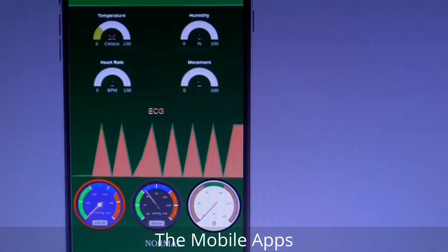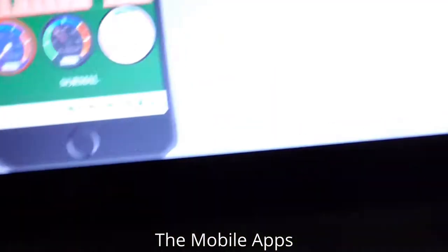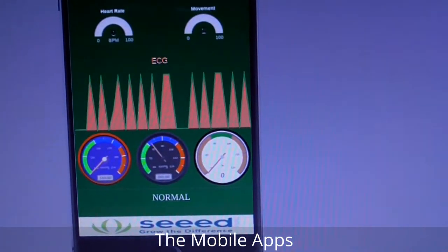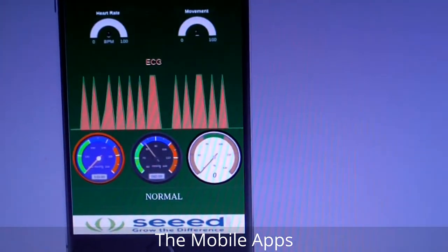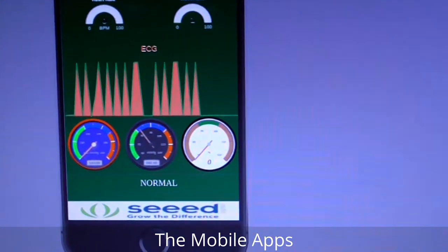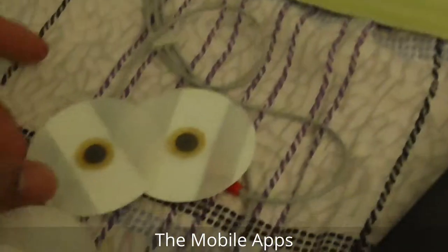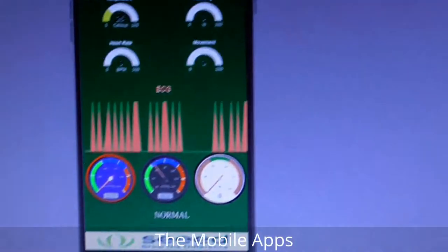Now the data is moving — data is coming from the sensor. It depends on you — you need to place it on the body for getting a nice ECG signal.